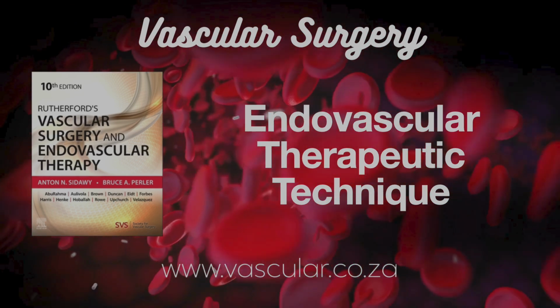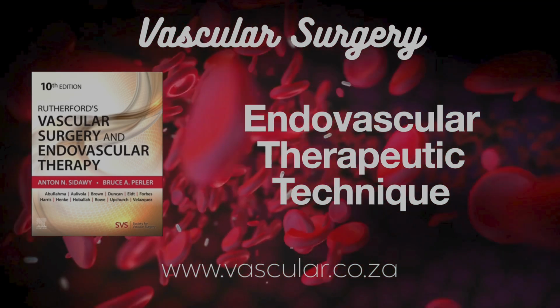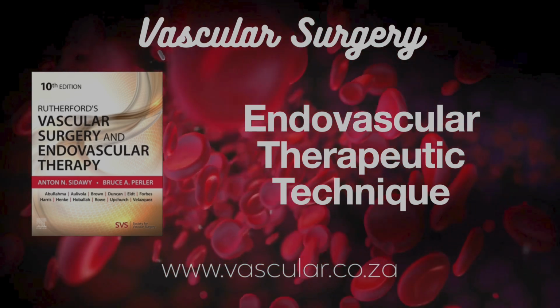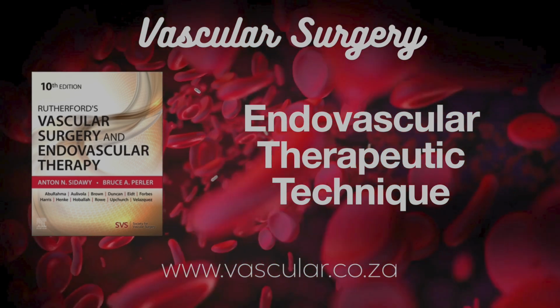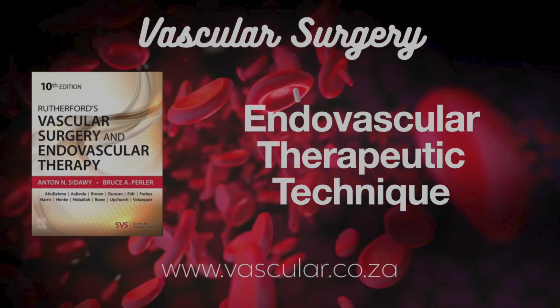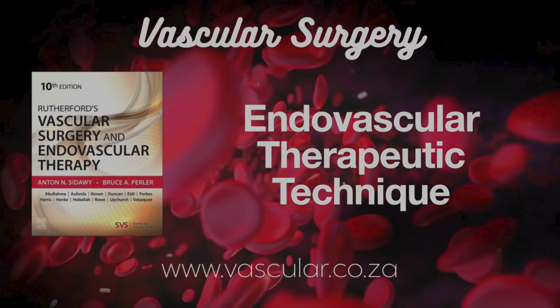Fascinating crossover. Now, a specific challenge. Crossing chronic total occlusions, CTOs, those completely blocked arteries. What specialized tools are there? Yeah, CTOs are tough, often long-standing, dense, calcified blockages. You need specialized wires and catheters. The goal is either to get through the original true lumen or go subintimal into the vessel wall layer and then re-enter the true lumen further down.